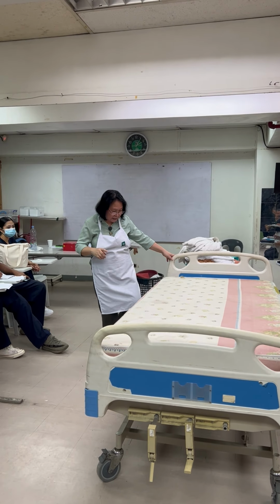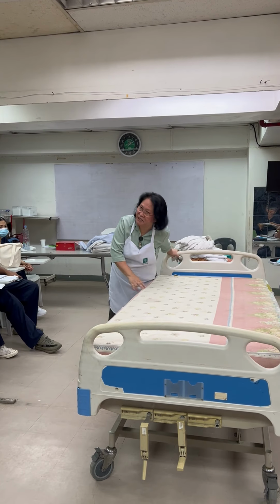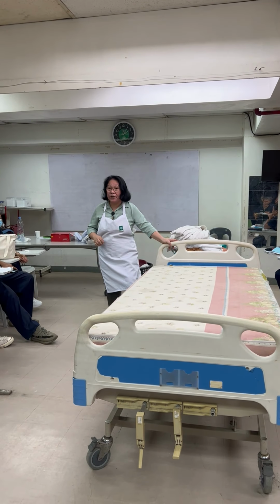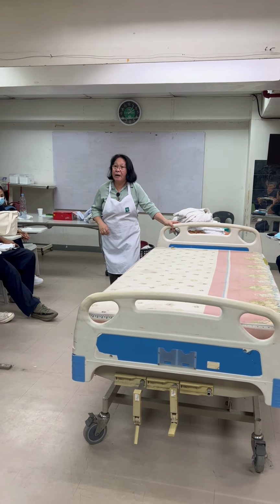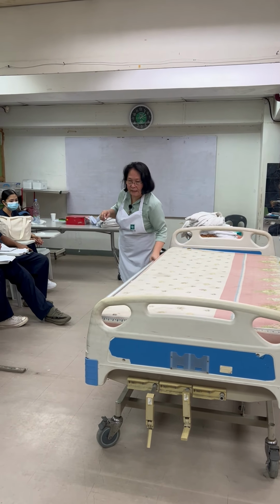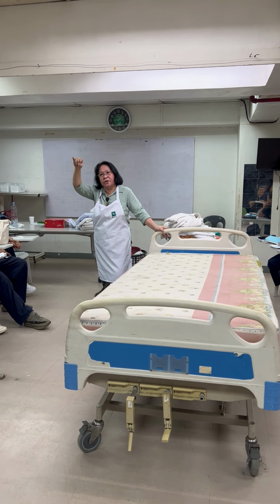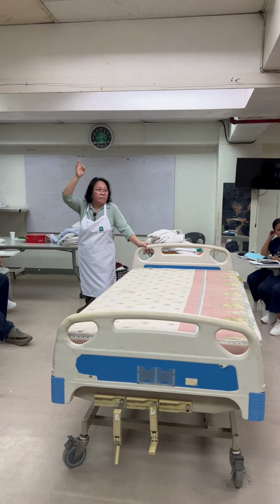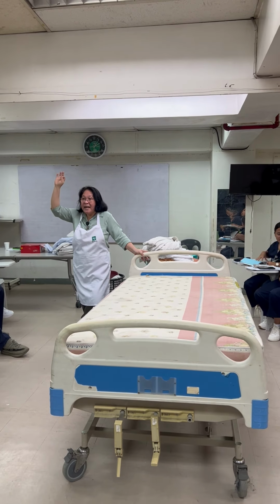Okay, next to safety. Another safety is lock. Magkuan ka, naisbog ang bed. So, lock ang iyahang caster wheels. No? Tawag ani caster wheels na arasad ni siya brake. Okay? And then, side rails niya. Okay. So, aside from that, we already have communication, privacy, safety, unsa pa? Prepare the materials, no?